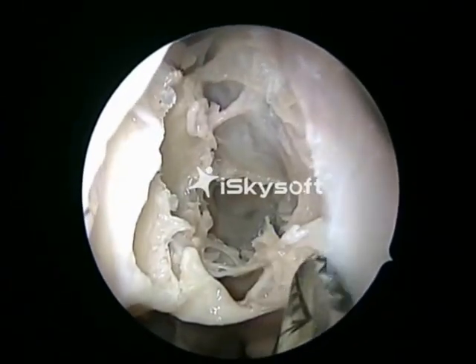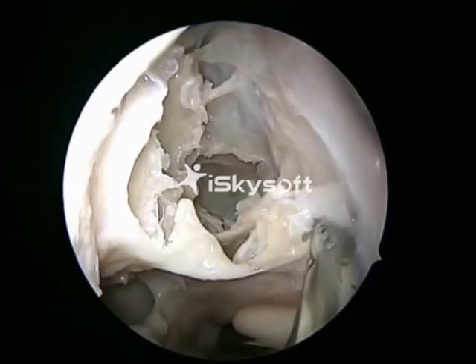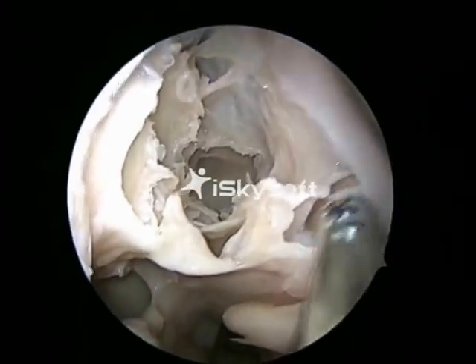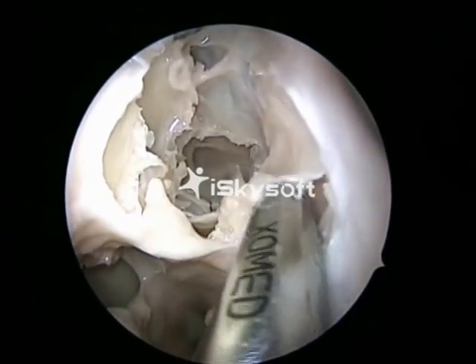The next step would be to open up the sphenoid sinus, and for that we follow the intermediate approach. We create a superior meatal window. The landmark for creating a superior meatal window would be the inferior wall of the bulla, which leads us on to the superior meatal window.